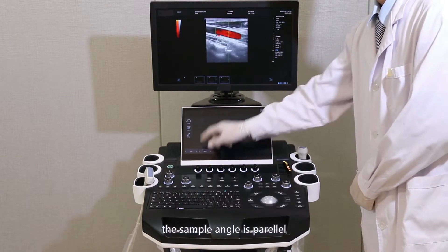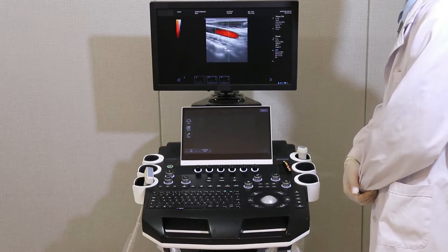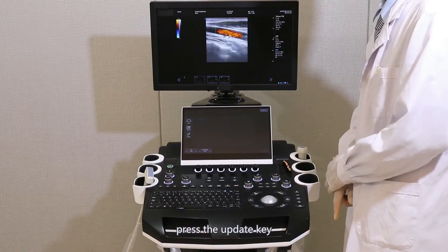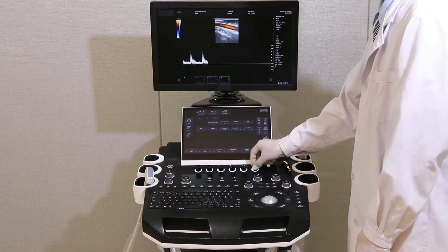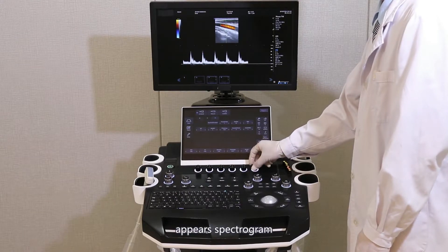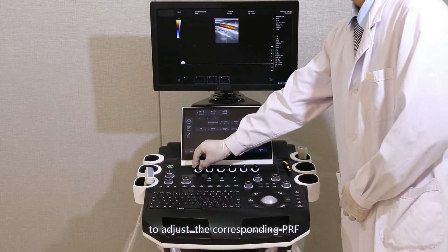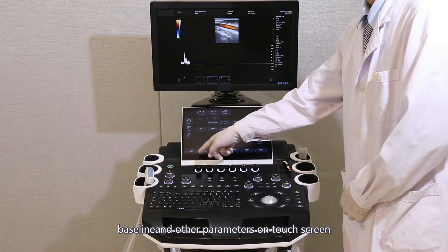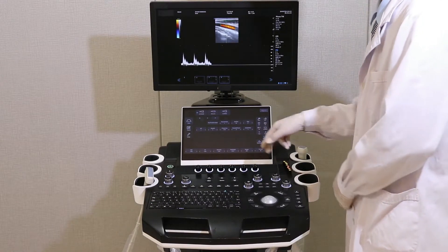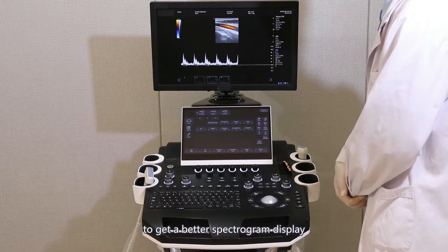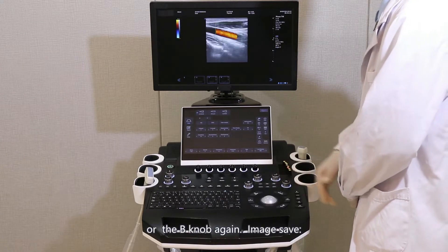The sample angle should be parallelized with the vessel wall. Press the Update key under the spectral state; a spectrogram appears. Adjust the corresponding PRF, baseline, and other parameters on the touch screen to get a better spectrogram display. To return, press the PW knob or the B knob again.